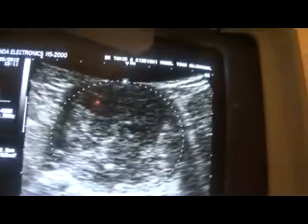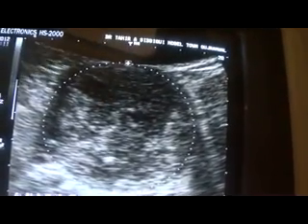I am giving a sweep to this mass. It does not change its shape, so it is a solid mass. You can also see its posterior wall — this is the posterior wall of this fibroid with no acoustic enhancement, confirming it is a solid mass.